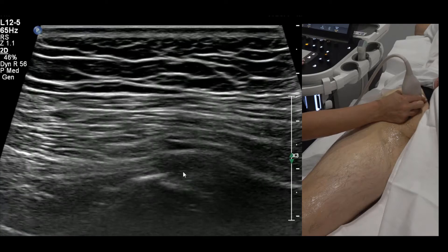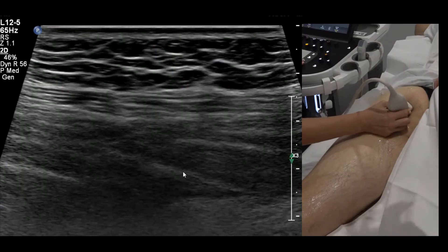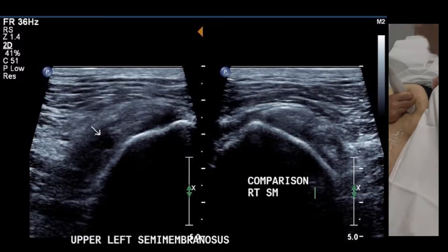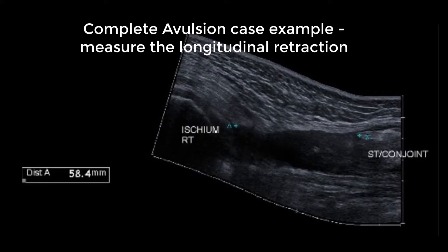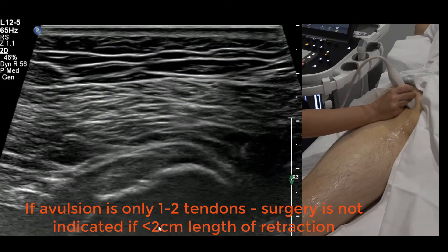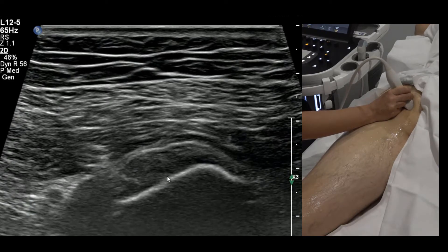An avulsion is where some of the hamstring pulls off the bone. Sitting in transverse looking at the hamstring origin, if you see a small black gap occupying 30% of the tendon, that can still be called an avulsion even without a bone fragment — it just means it's pulled off the bone. Hamstring origin tears will usually heal, provided there is no displacement or a large chunk of bone displaced away from the ischium.